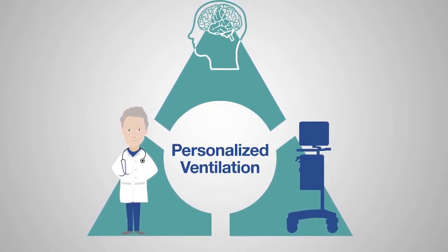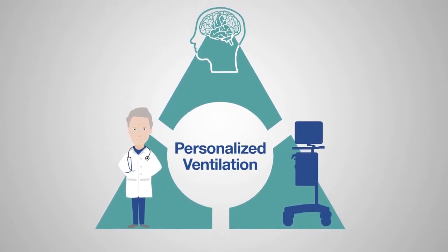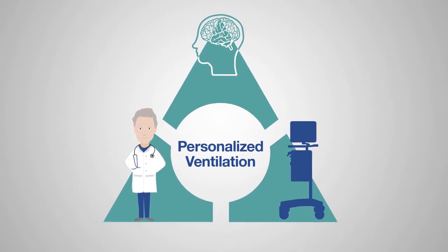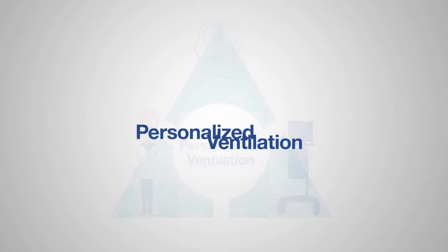I have found that patients who are ventilated with NAVA are weaned sooner. For me, personalized ventilation with NAVA is the best and most important change that has happened to intensive care in my long career as a doctor.